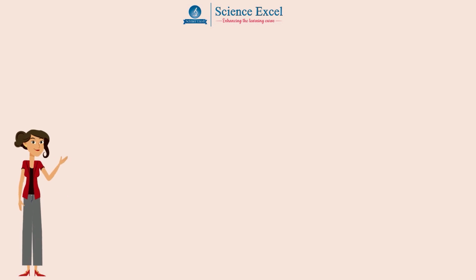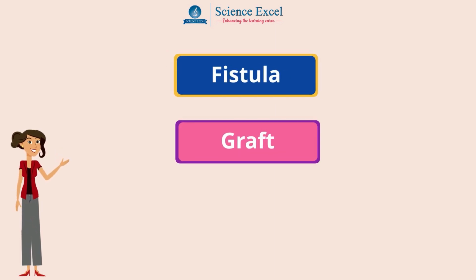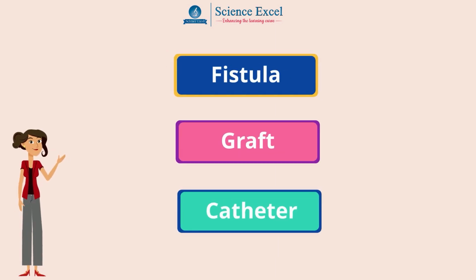To get the blood into the dialyzer, the doctor needs to make an access or entrance into the blood vessels. This access is placed with a one-time minor surgery, usually to the arm, which can be one of the following: fistula, graft or a catheter.